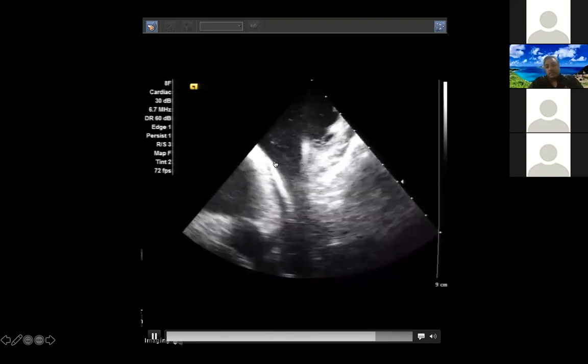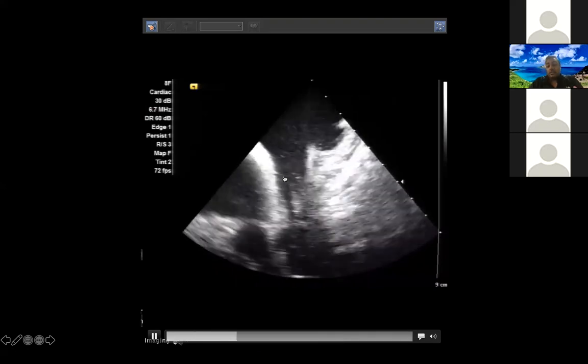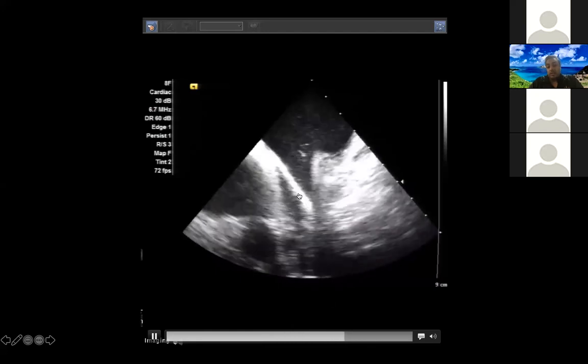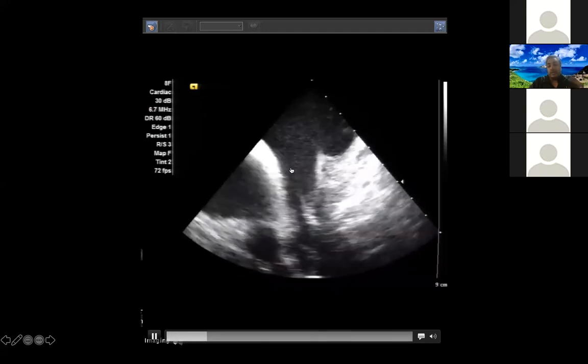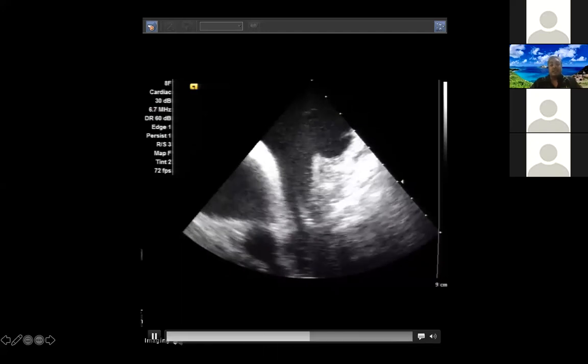And so you can very clearly see, I'm pushing the wire up from the groin. And again, as long as I don't feel resistance, 9 times out of 10, that wire will just show up in the SVC. If it doesn't show up there, I don't keep pushing because I know that it might be getting caught somewhere. It's going to end up in the wrong place. And so there's really no shame in using fluoro.